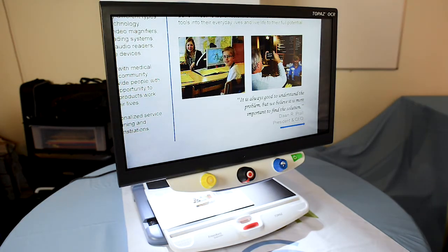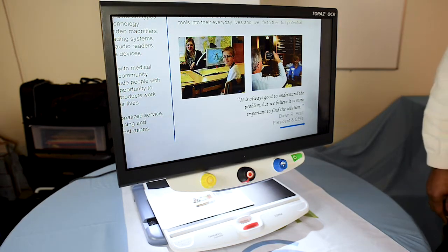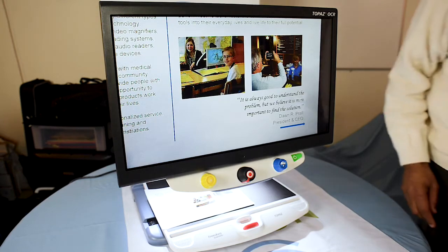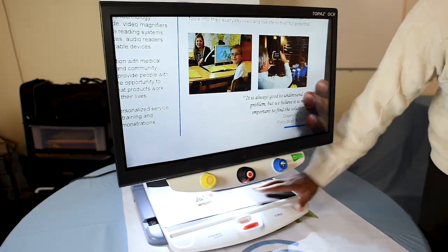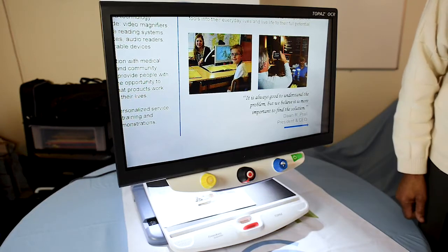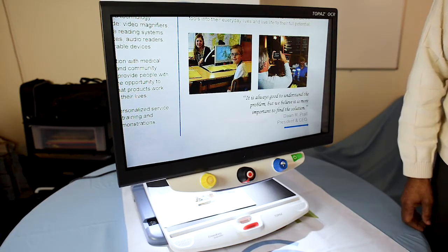The next feature I'd like to show you is the XY table. This is the table on which you place documents, newspapers, magazines, checks — any sort of thing that you want magnified — you place it on this XY table.